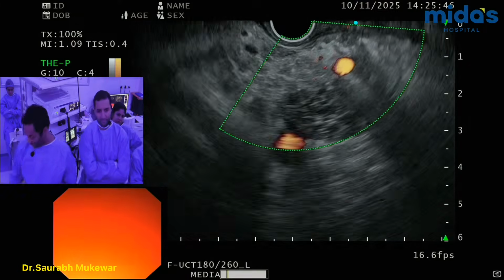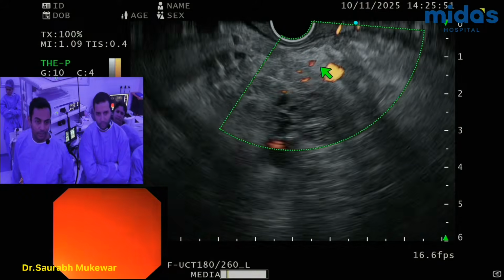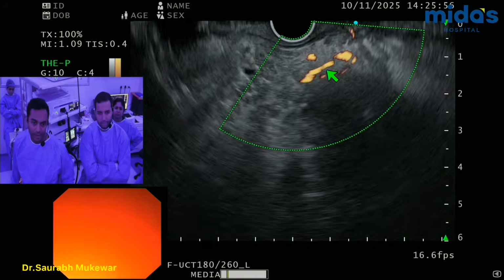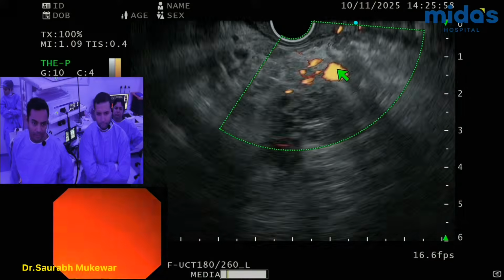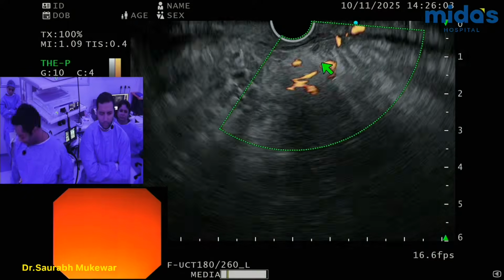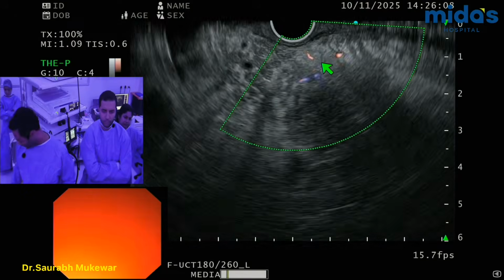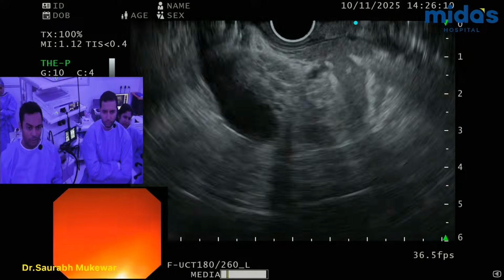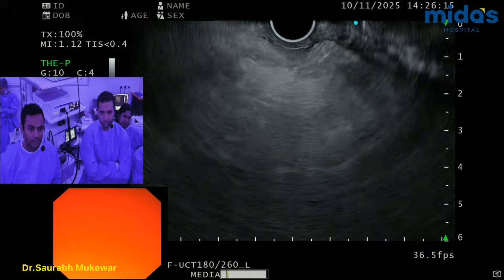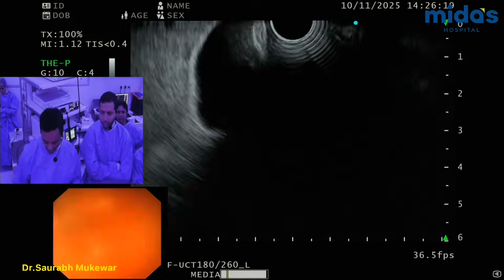So you could see there was a bit of a flow initially post biopsy. Right there was all the flow over there. This is the flow in the surrounding area. It's not uncommon for them to have multiple vessels around. It's a vascular lesion, but these are arterial structures around there. Anyway, I think it's fine. Now it's settling, not much blood. And I'm going to stop here in view of the hematoma that's formed right there. It's self-limited, so I wouldn't be too concerned about it.